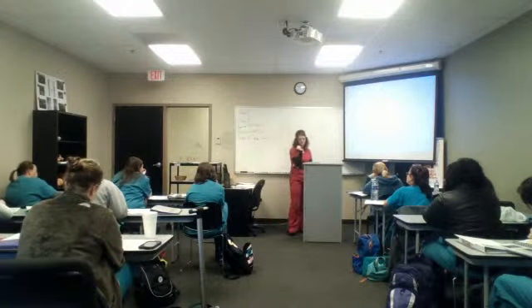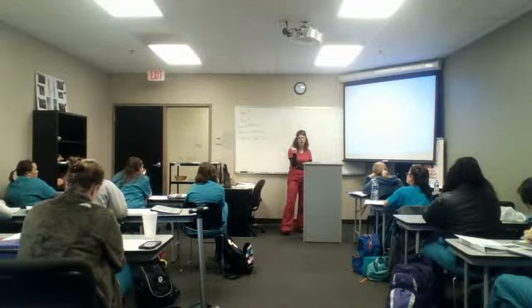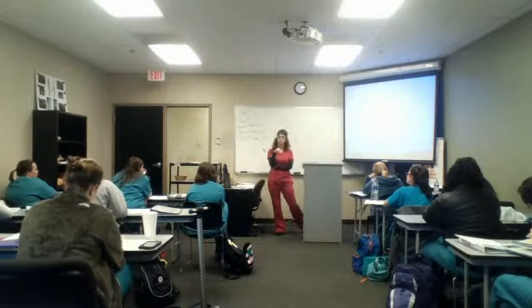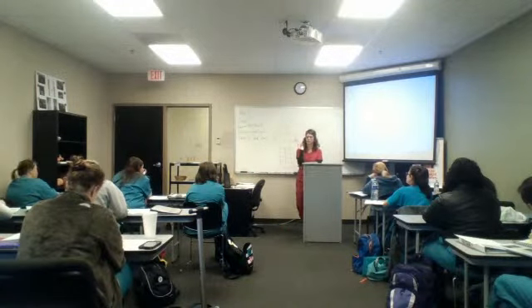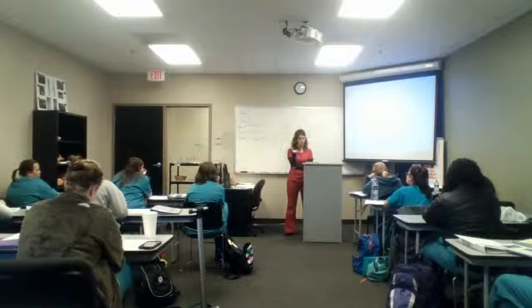And it is a finding that you need to report on your tech sheet. It's not like it's dangerous to them, but if they ever needed to go in and do an ablation, which is where they burn those veins out, they would need to know that sort of thing, okay? So normally, lesser saph enters pop, but if it doesn't, it's called a Giacometti vein.